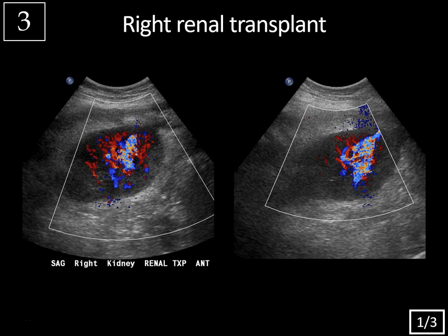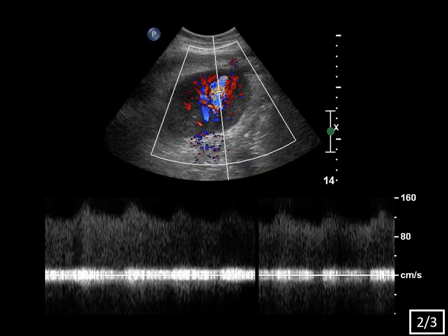On spectral Doppler you again see a high velocity, low resistance waveform — diastolic and systolic flow are both very high velocity with aliasing. In this case we would see high velocity, low resistance flow within the artery and turbulent pulsatile flow in the segmental draining vein.